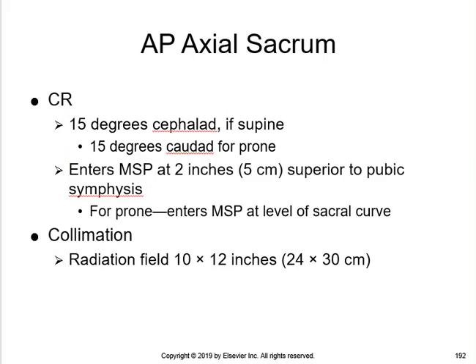You can shoot these PA. I've never done it before. I never worked in a hospital where that was routine.